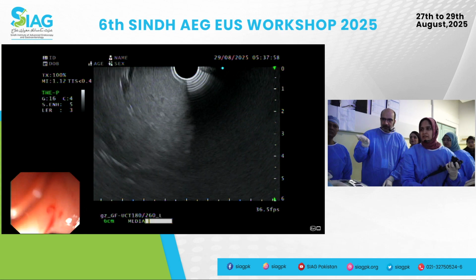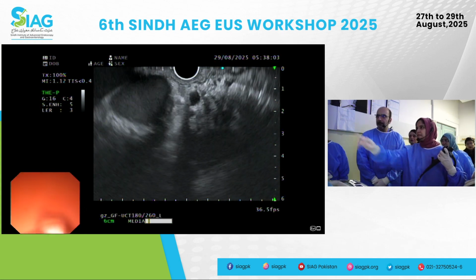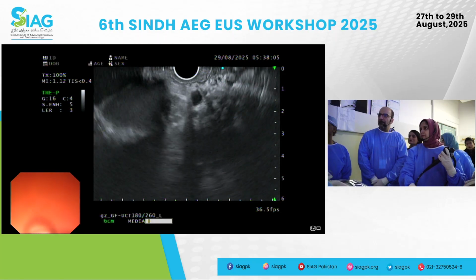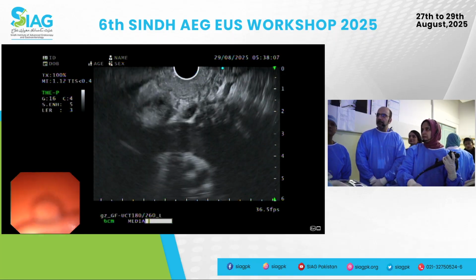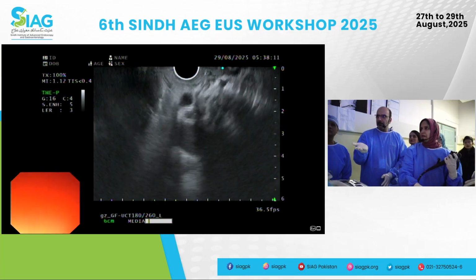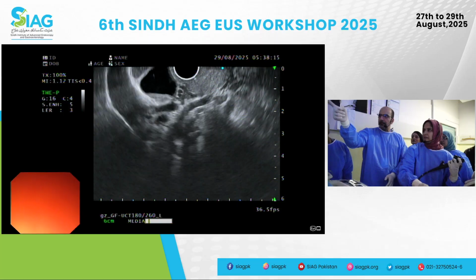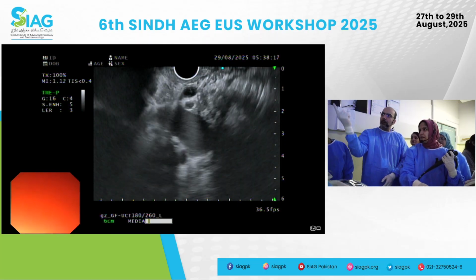Okay, I think I'm out again, lost. So try, start all over. Okay, good. Yeah. Get in there. Yeah, that's... Can you take us to the other room, please? Okay, now go.